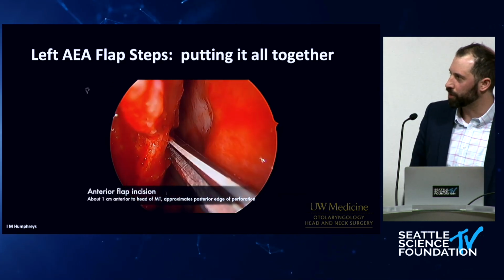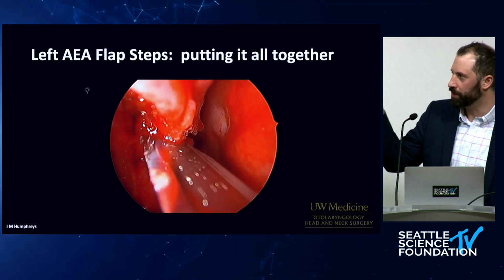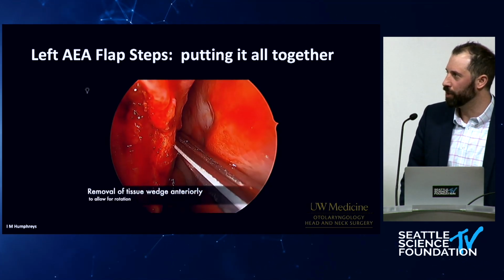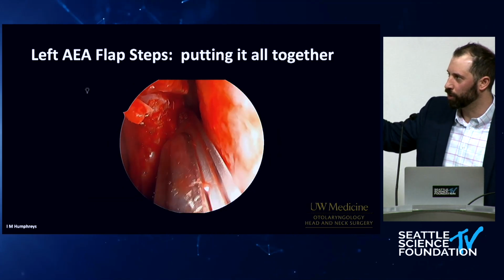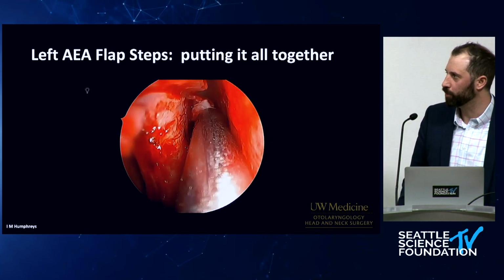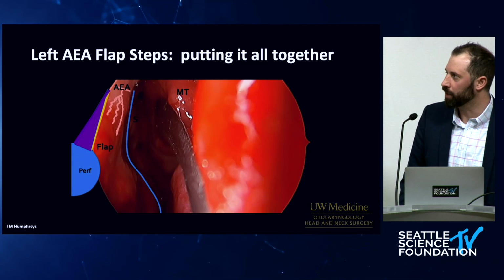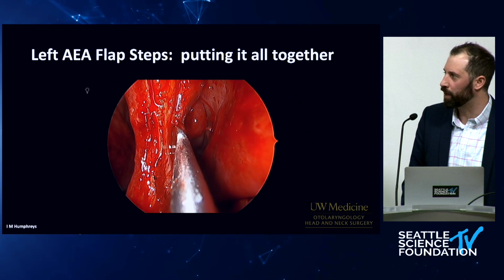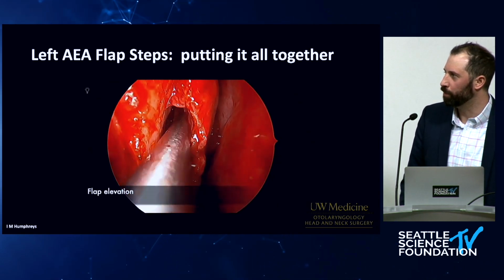We saw this before, just again, a better approximating and appreciating the relationships of this anterior incision, and then the removal of the wedge of tissue along where the flap is going to now rotate from floor up over the septal perforation here, using a shaver to do that. Again, just really emphasizing the offsetting of the incisions to make sure that you have a pedicle to perfuse blood supply to it. And then now it's the fun part, the easy part.